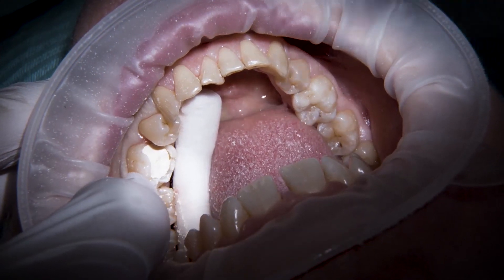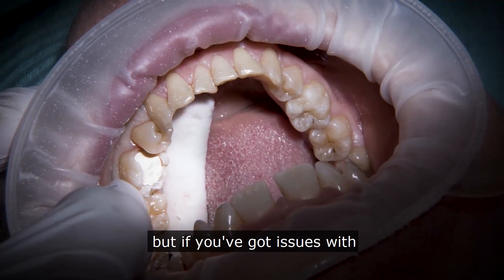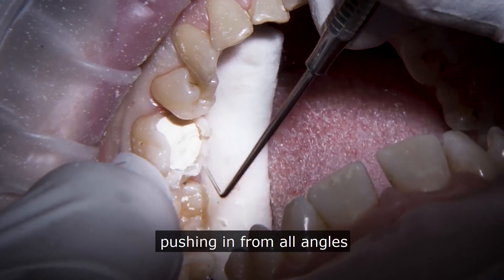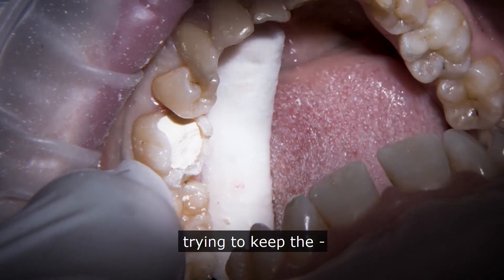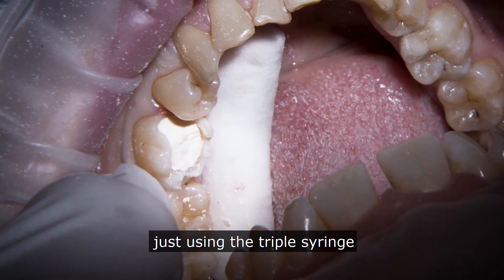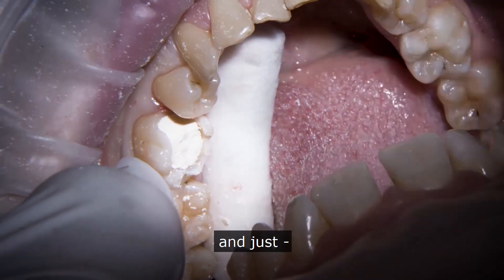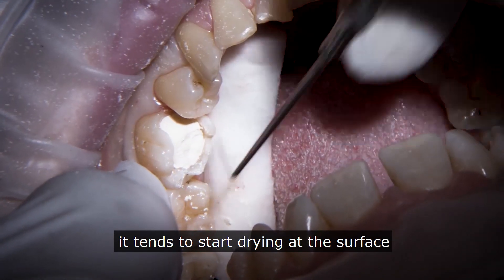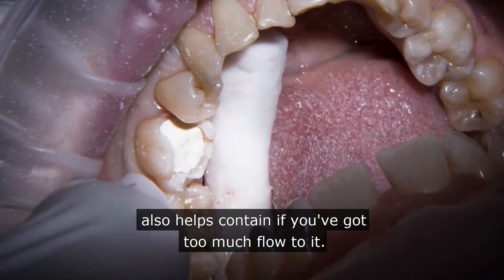One thing I didn't mention: we've got a nice dry field here, but if you've got issues with any moisture contamination — saliva pushing in from all angles — just when you first place it, try using the triple syringe and air drying on it. It tends to just give a nice surface drying and also helps contain it if you've got too much flow.